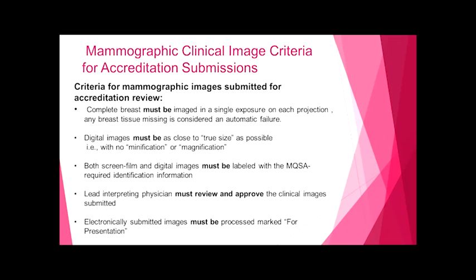Again, selecting the images and critiquing those images, and having the physician, the technologist, maybe some more than a couple of people look at the images and critique them, is important. Digital images must be as close to true size as possible with no minification or magnification. Both film screen and digital images must be labeled with the MQSA required identification information.